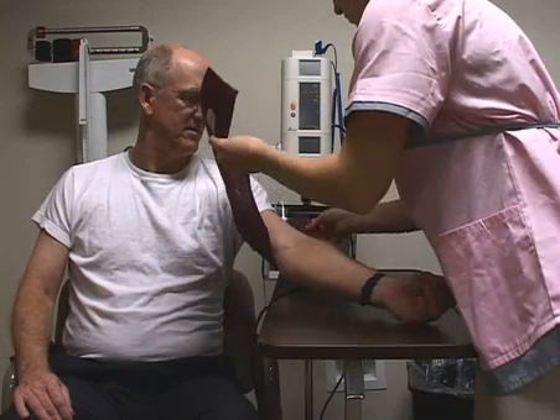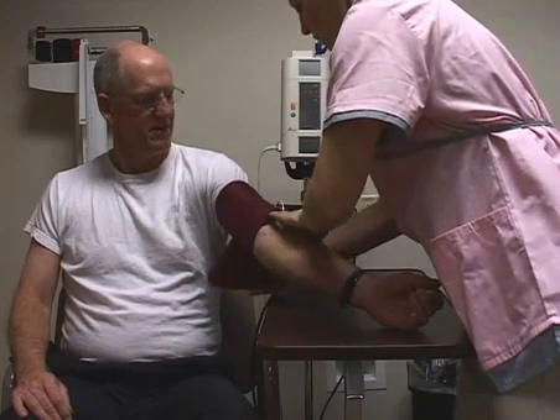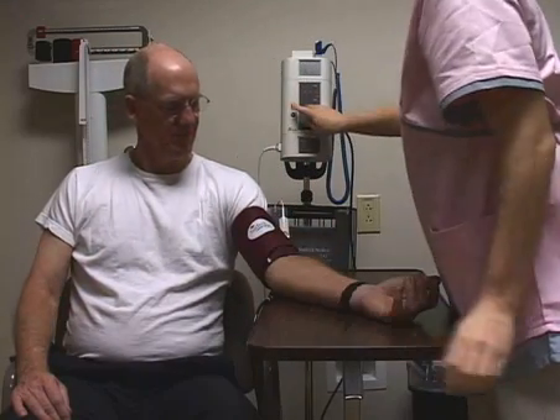Begin by properly placing the cuff on the arm. With the cuff in place, press the automatic blood pressure button.